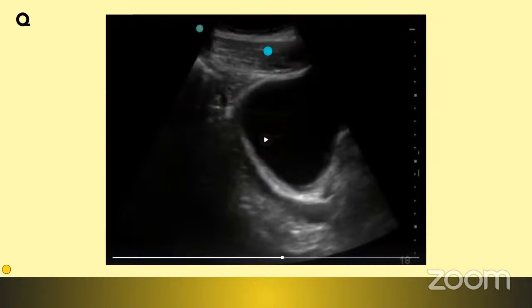If I look carefully, I'm able to appreciate this area. Actually, in actual sense, it is this complete one. However, if I'm a beginner, I would just say this part. So this is the actual part. We're able to see something here. This is not completely anechoic, but hypoechoic.